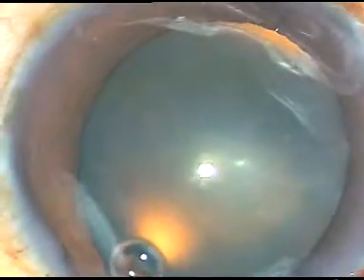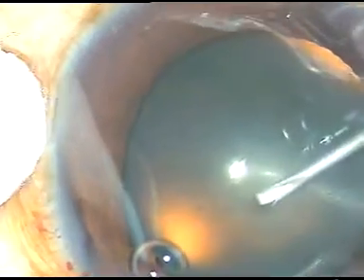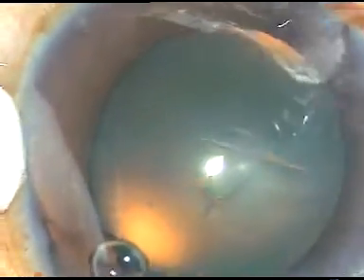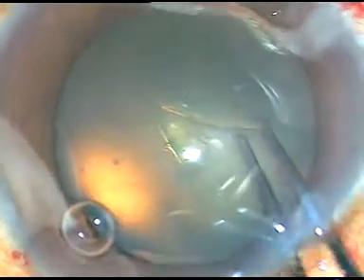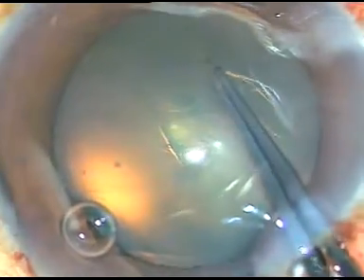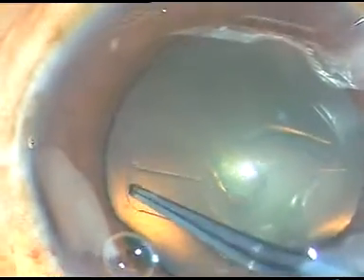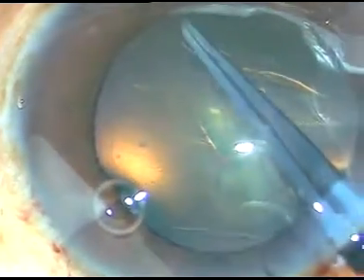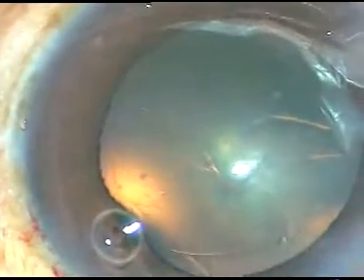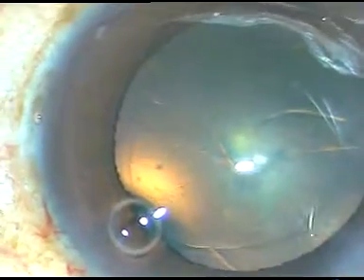Capsular rhexis is to be done. This is a 26-gauge bent cystotome — I make this cystotome myself. With the help of a Utrata forceps, capsular rhexis is attempted. At 3 o'clock it tended to go to the periphery. It was retrieved and the rhexis was completed.